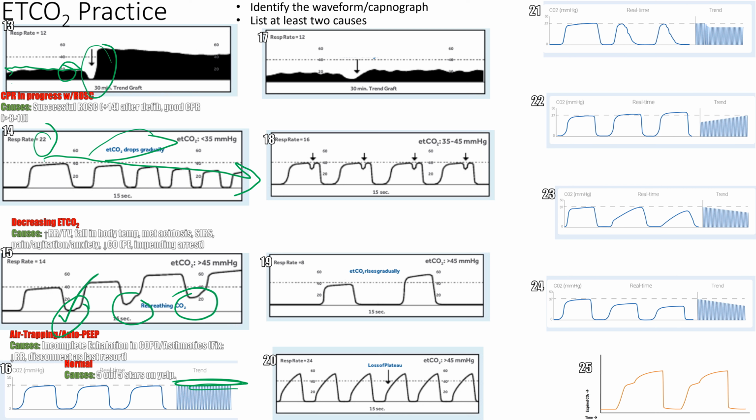What about 17? 5 out of 5 stars on Yelp. So what is number 17? Looks like an arrest because it looks like it's stolen from the other slide that said things about arrest. End tidal CO2 is less than 20, poor perfusion, and maybe you make a little bicarb push real quick, just to appease the gods. Or we were doing CPR, and then we got ROSC. Usually it's a 14-point elevation, and usually you're above 30. Maybe that's 30, it's hard to tell. Okay.